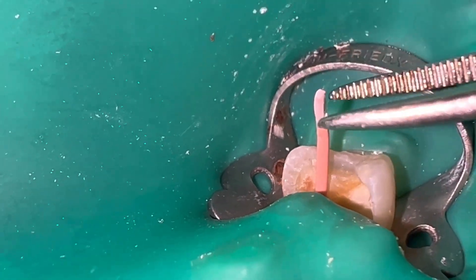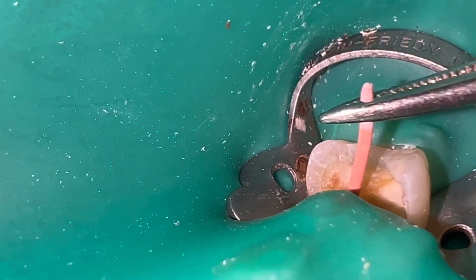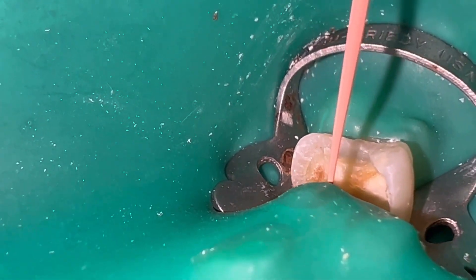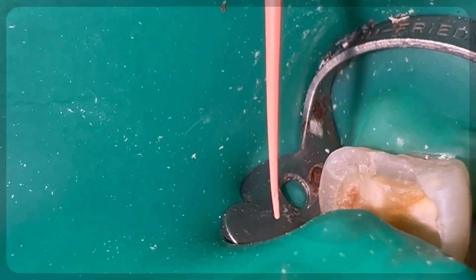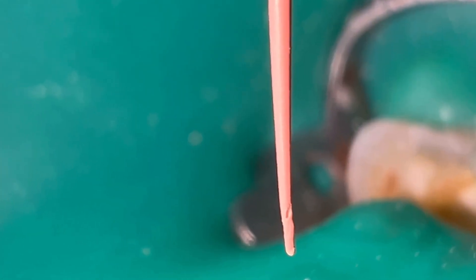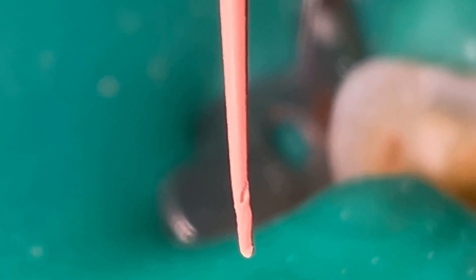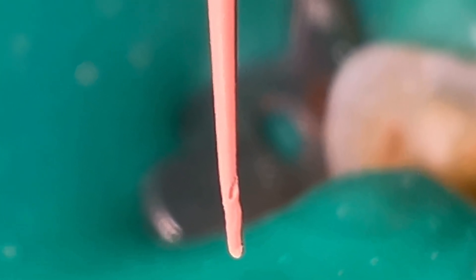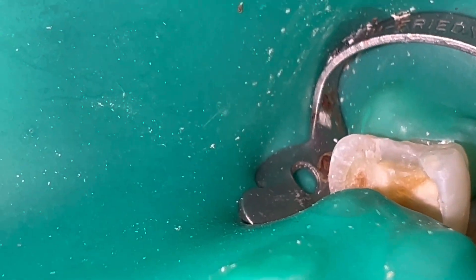For example, in a lower molar when we have a confluence between the mesial canals, it is advisable to work on the mesiolingual canal first. This is because it is usually straighter than the mesiobuccal and it is more difficult to strip because the canal is more centered in the root.